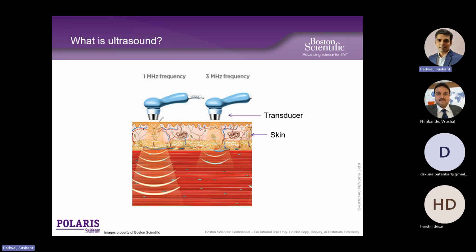So that is very important because when we are trying to take ultrasound images, whether the image quality or the depth of image is important, it is determined by this very factor. And also, the frequency of ultrasound is directly proportional to the axial resolution or the image quality. So higher is the frequency, higher is the axial resolution, and you get a good image quality.